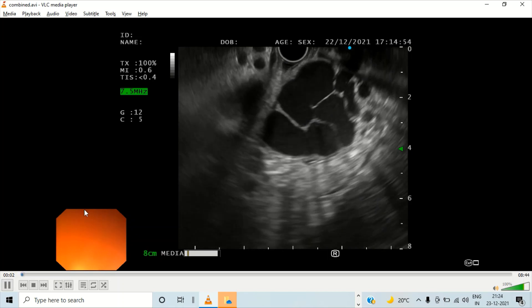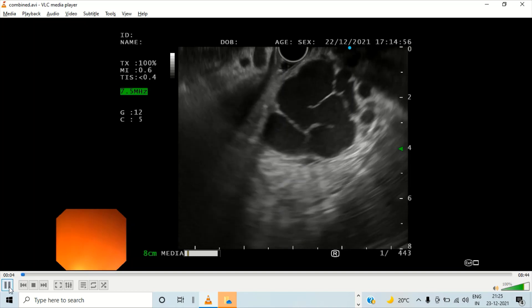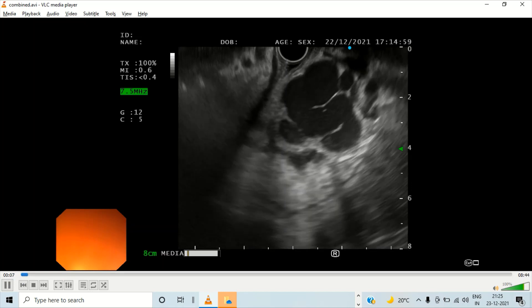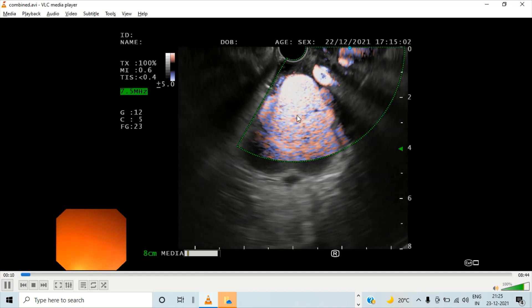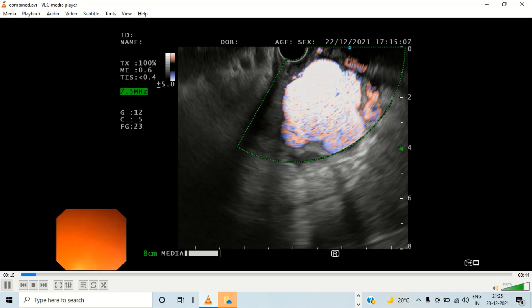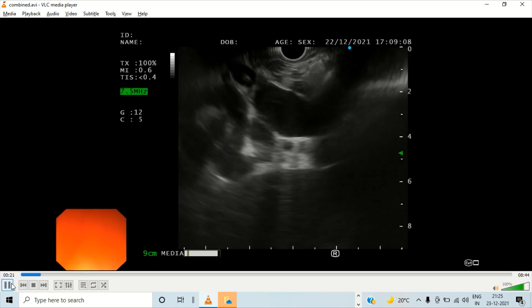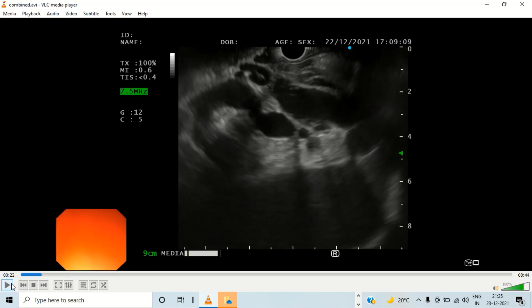This is basically the gastric varix, which can easily be visualized when the scope is around the GE junction with the scope in the neutral position — that is the left hand in the sleeping position. We can see the conglomerate of the varices, and you can see the extreme turbulent flow inside these blood vessels on Doppler. The problem is that with the left hand in the neutral position, it is very difficult to perform the therapeutic maneuver.